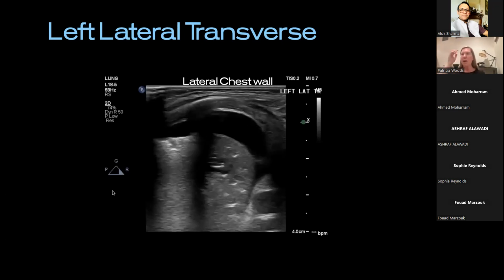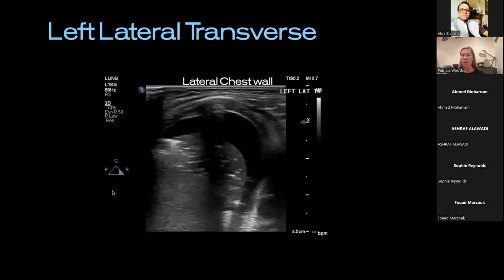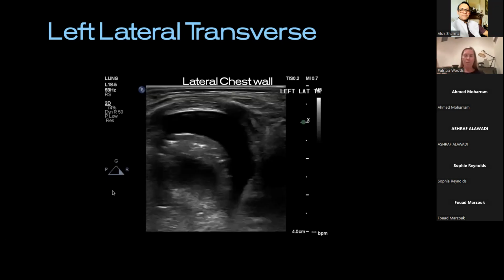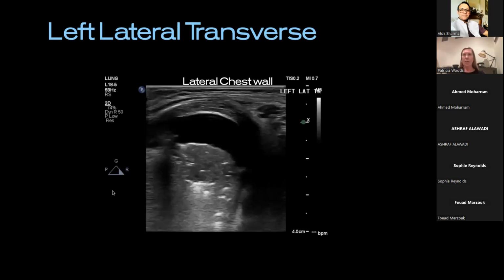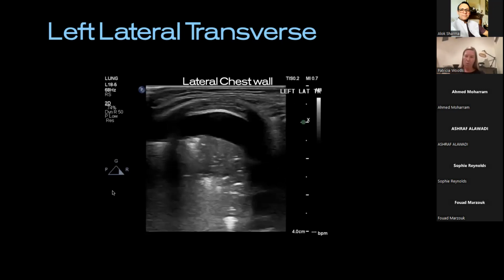And in my mind and in my notes, more importantly, I start drawing some diagrams then, and it helps people understand the 3D nature of the fluid that's surrounding the lung and suspending the lung, and really can help put in your mind, you know, if what, so what, is it that important right now?